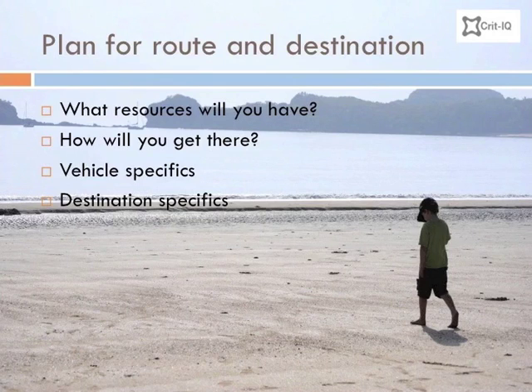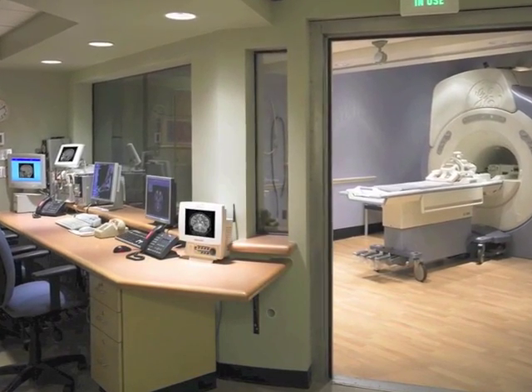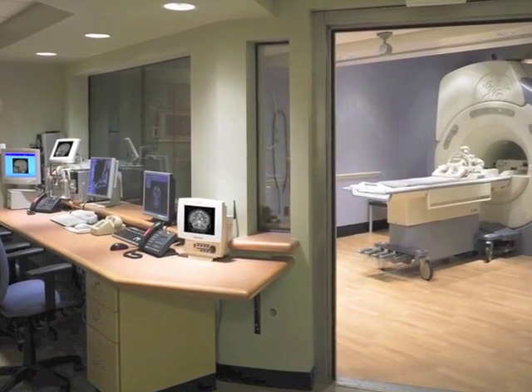Think about how things will need to occur in the destination environment. If the patient needs to transfer from one ventilator to another, when will this occur? Where will the IV pole go? Will this be in my way? Where will the monitoring be so that I can see it clearly? Special environments such as MRI or the cardiac cath lab present specific challenges.